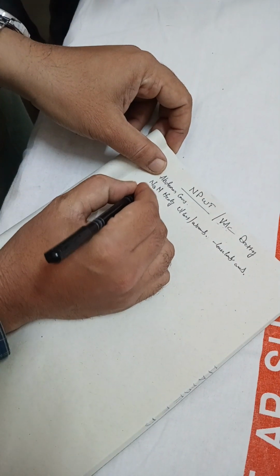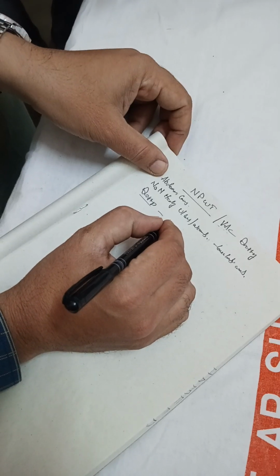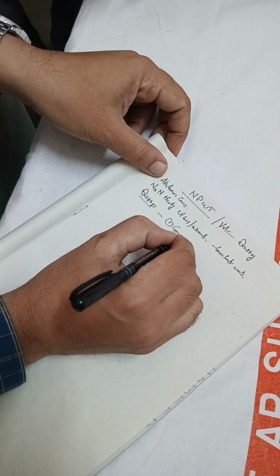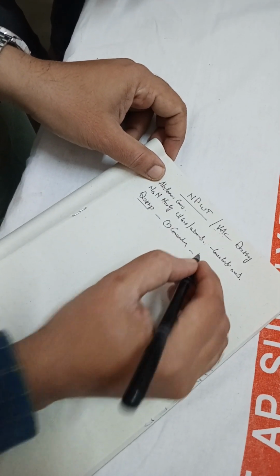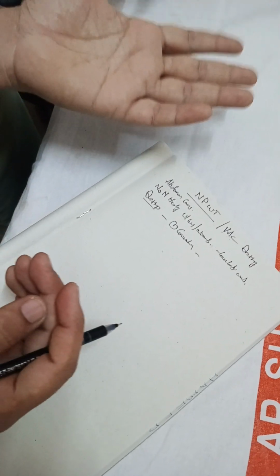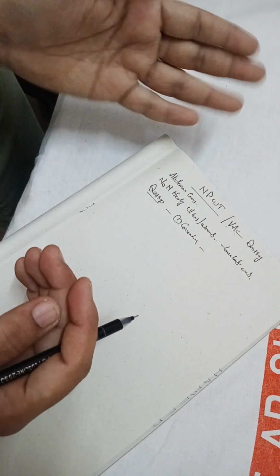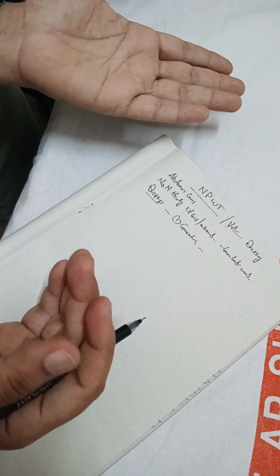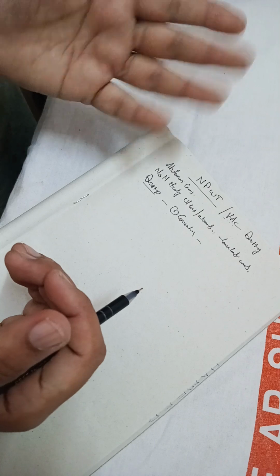Okay, so dressings are many types. The most common we do are the conventional dressings where we use gauze, and we wash the wound with hydrogen peroxide and betadine, and then we put a saline gauze or anything, and then put a pad, and then roller bandage, and we see that if there is soakage we have to change it again.